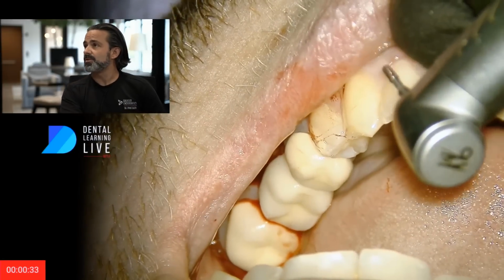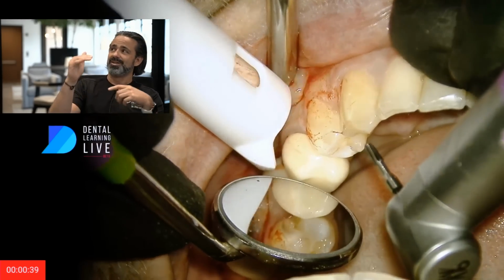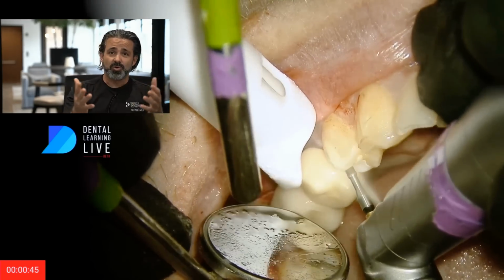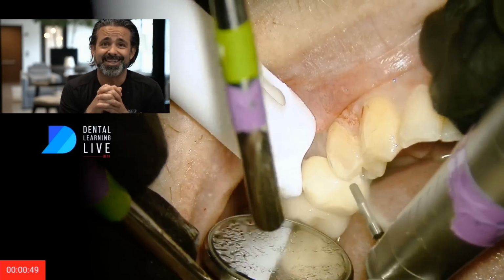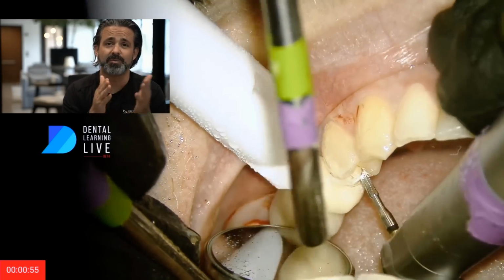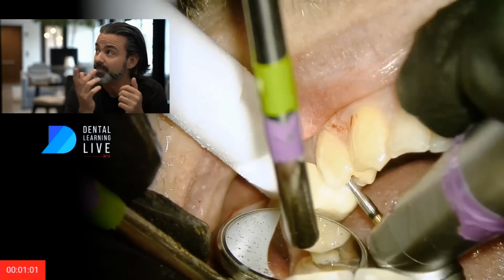It's tooth number 21, and it's one of those fast break situations where you go halfway down the root, and if you look on that x-ray, it bifurcates, which is cool anatomy, but it can be really frustrating when you can't get into the lingual canal or whatever's going on. It's down deep. I'm going to show you how I problem solve it, and how the GentleWave actually made that easier, how I employed that technology for it.